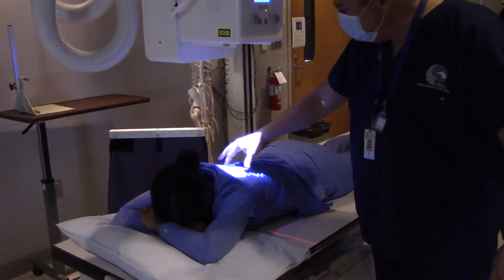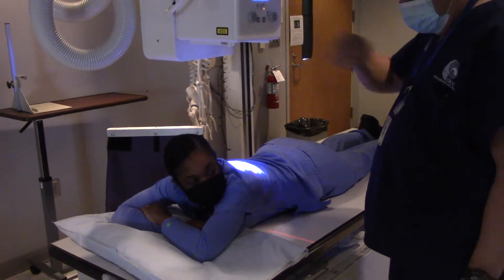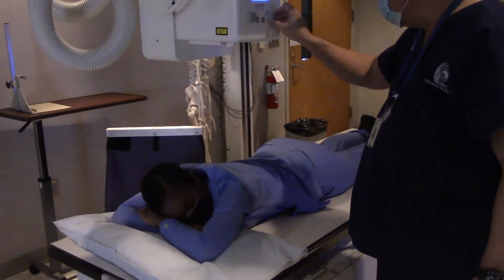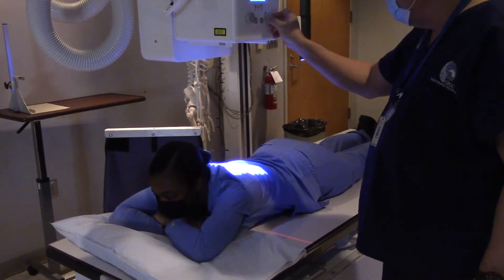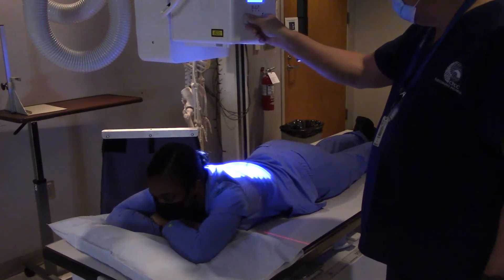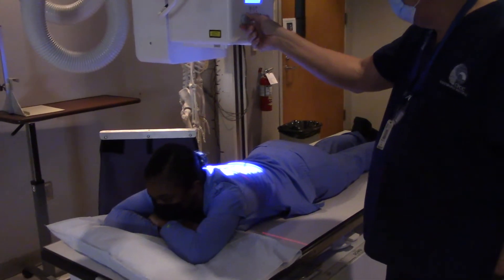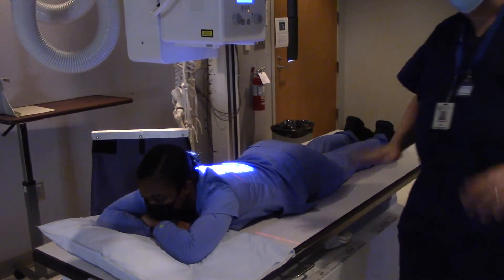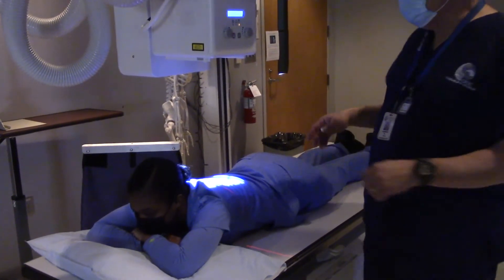Oh, it looks like you've already got some barium. Did somebody splash barium on you in clinic? A three-year-old got loose with some Clorox. Okay, so what I'm going to do is tighten this collimation down to about seven inches wide by 17 inches long. That should be plenty of collimation to be able to see the esophagus.